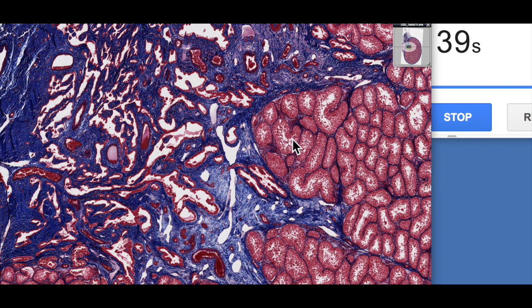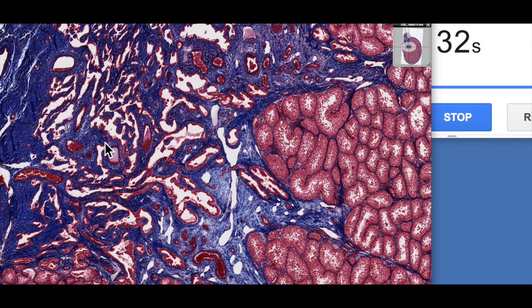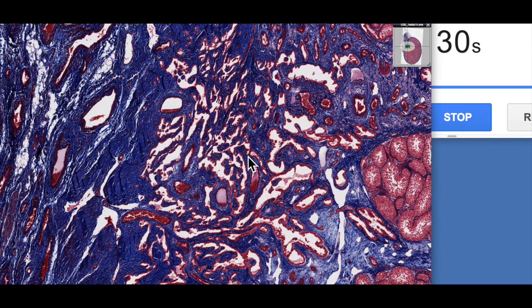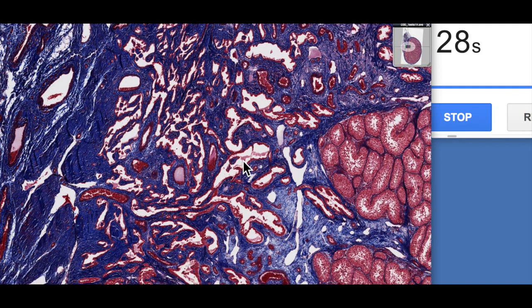From the seminiferous tubules the sperm are made. They leave via the straight tubules, these structures here, and then they enter into the rete testis before moving on to the efferent ductules. We'll talk more about the pathway of sperm in another video.